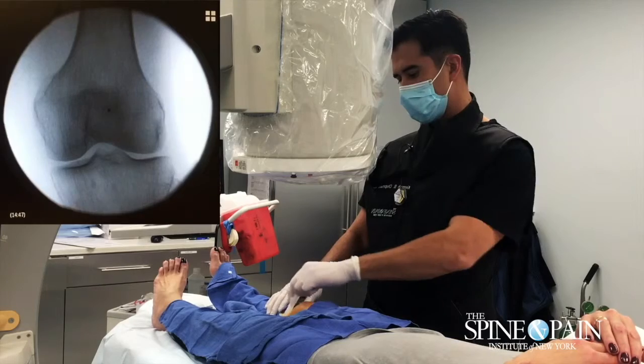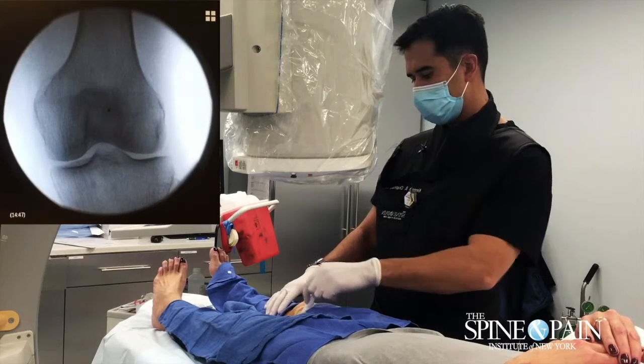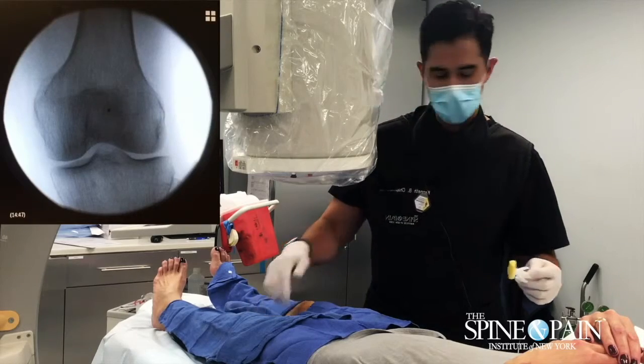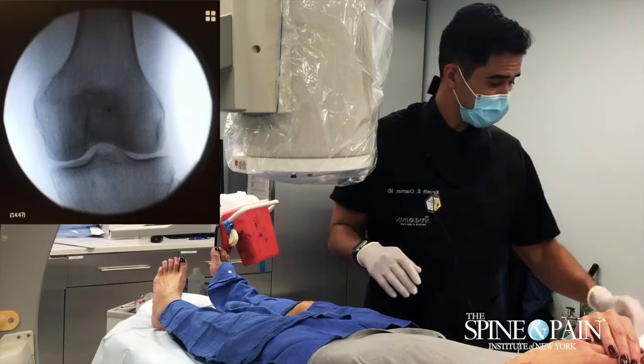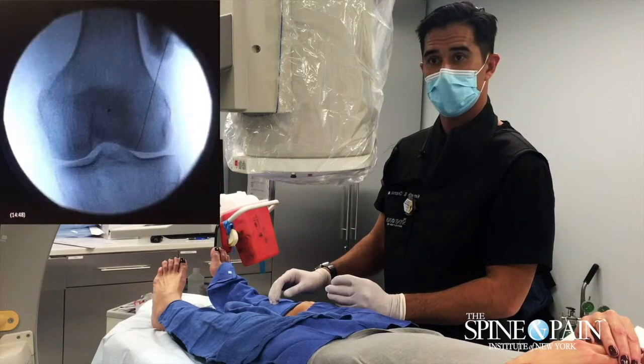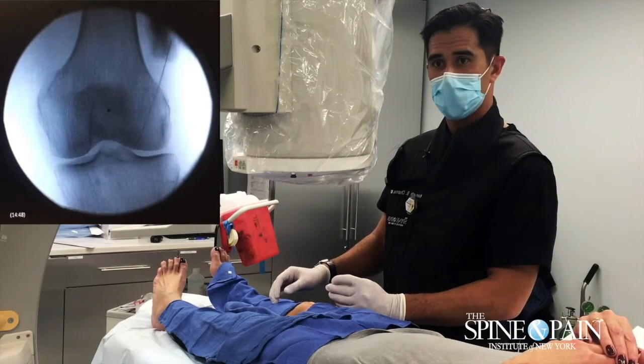We do this under x-ray because we want to make sure this two parts of gel-like substance that we put in there is getting into the space. So under fluoroscopy we can see for sure that that's getting there. So we should have more pain on the lateral aspect.